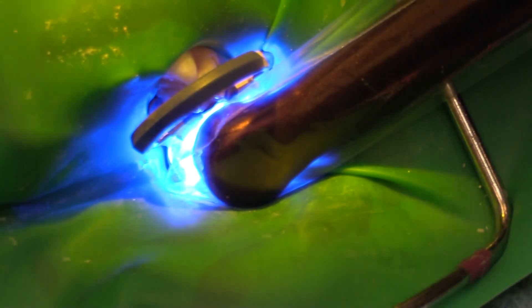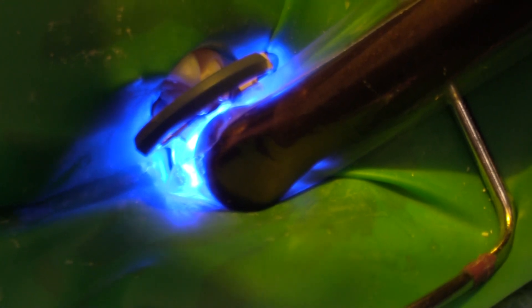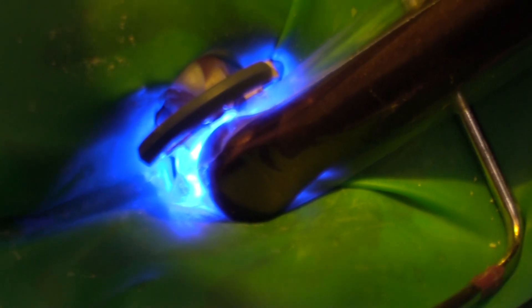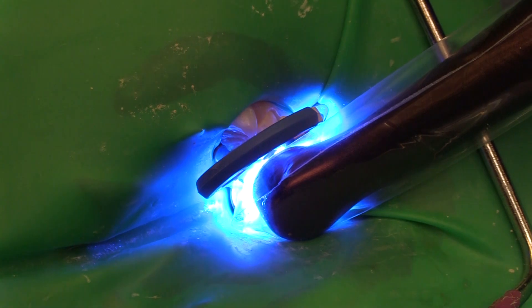We're going to put a little sealer over top — the next step is flowable again over the entire restoration. Just seal everything up, get those grooves covered and give that kid some better longevity. There are studies and literature out there talking about using sealant-type material over top of your resin composites and how that increases the longevity of those restorations by decreasing leakage. Just getting a nice thin layer of that Estelite on top, then we cure again.